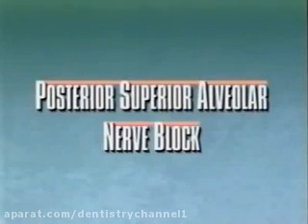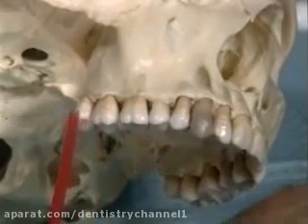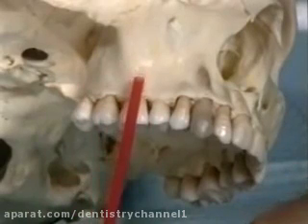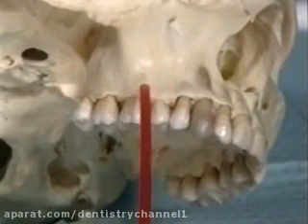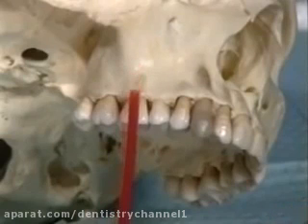The posterior superior alveolar nerve block is used to produce anesthesia of the posterior maxilla. Usually, all three maxillary molars are anesthetized, along with the surrounding periodontium and maxillary buccal mucosa. However, a separate supraperiosteal injection over the maxillary second premolar, or mesial buccal root of the first molar, is required to ensure complete anesthesia of the first molar.